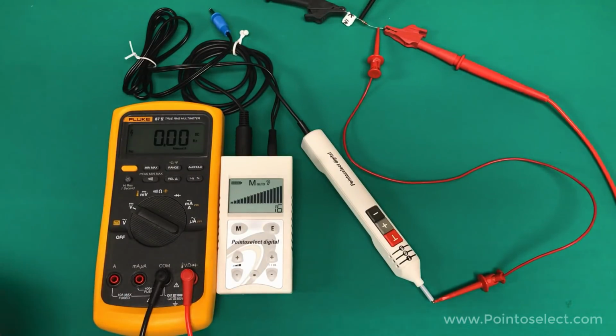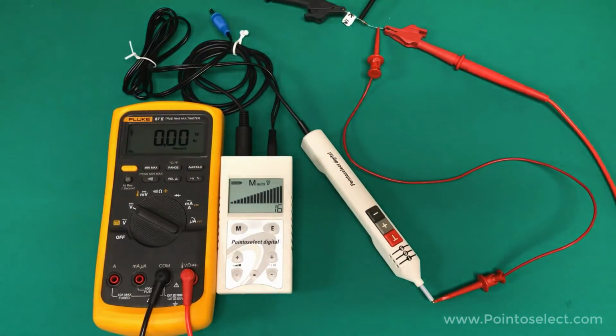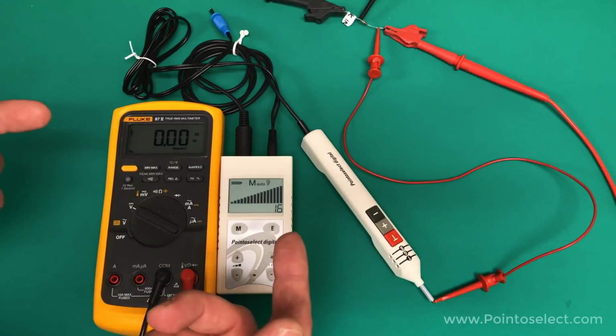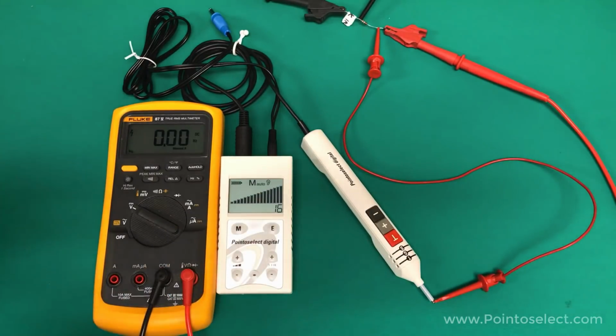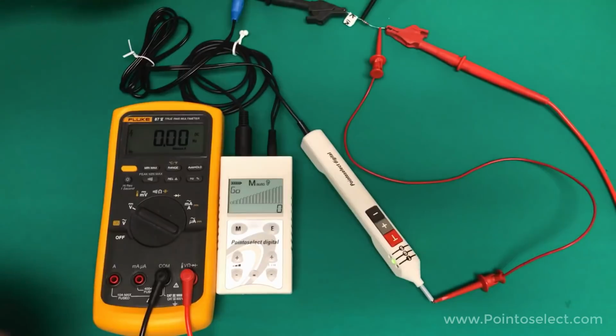And so with that, we are ready to test. I'm also using a 1K ohm resistor in the circuit. That provides the test load, and that's important when you're testing an output circuit like this because it simulates the human that would be in this circuit if you were treating a human. If you don't have that test load in there, you won't get accurate results. So we'll go ahead and plug that in.